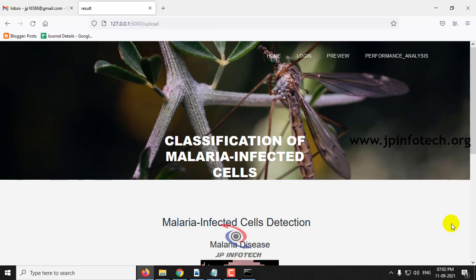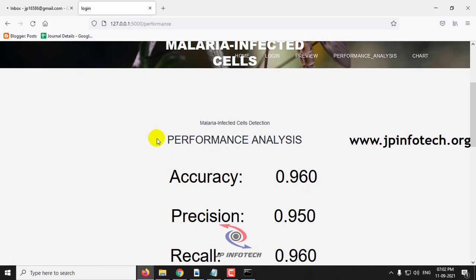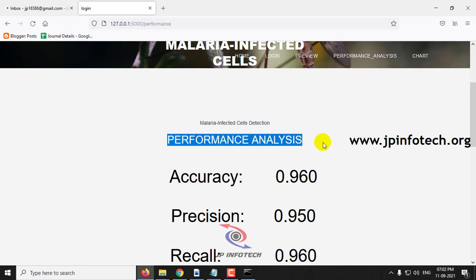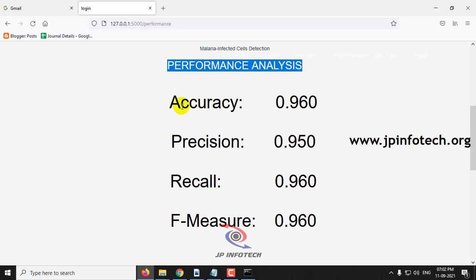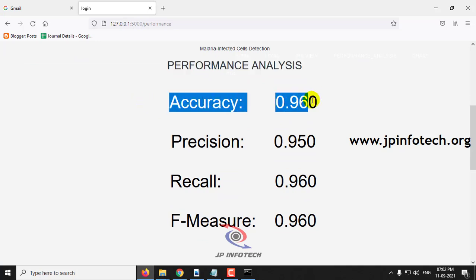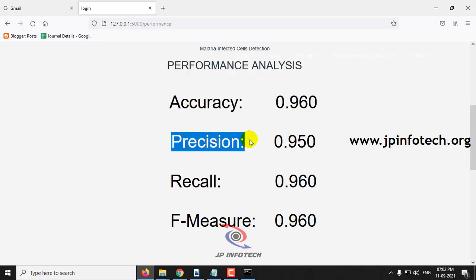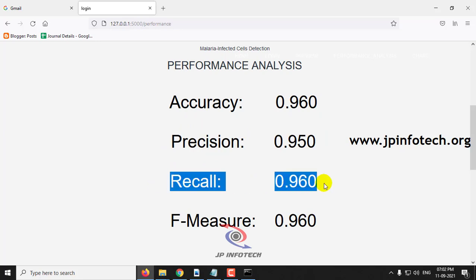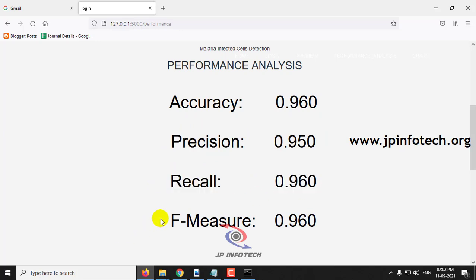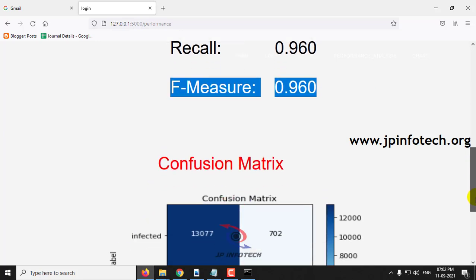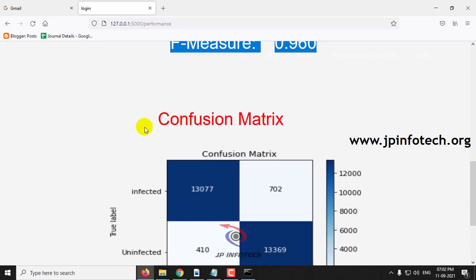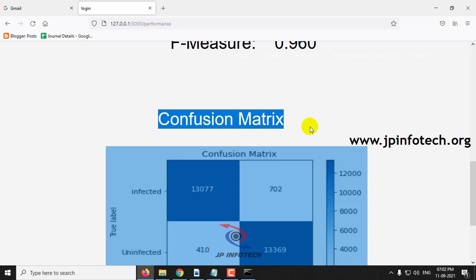Now let me go to the performance analysis part. In the performance analysis of this malaria infected cell detection, you can see the accuracy is 0.96, precision is 0.95, recall is 0.96, and F-measure is 0.96. Here you can also see the confusion matrix.